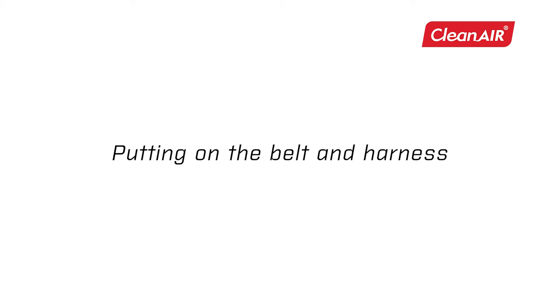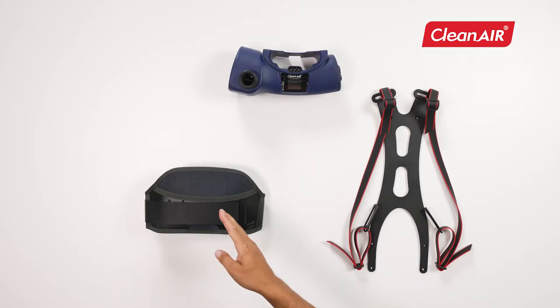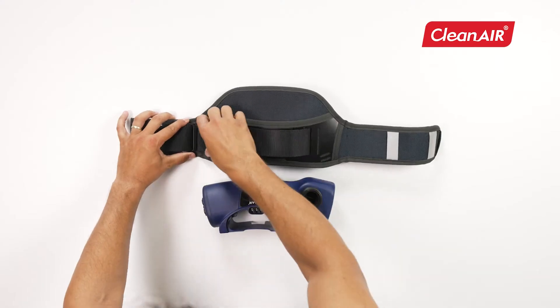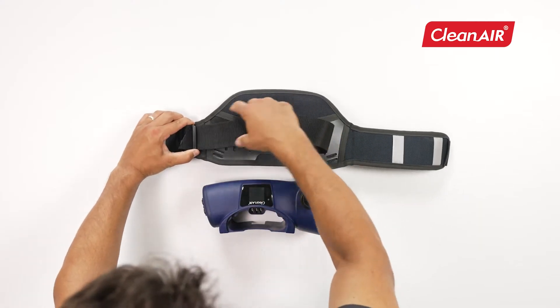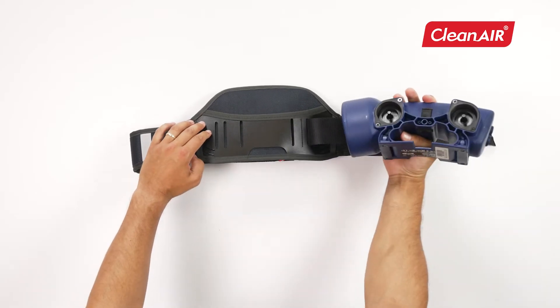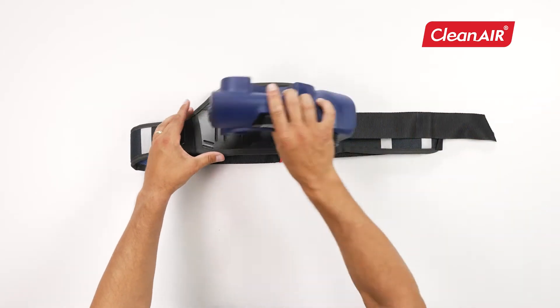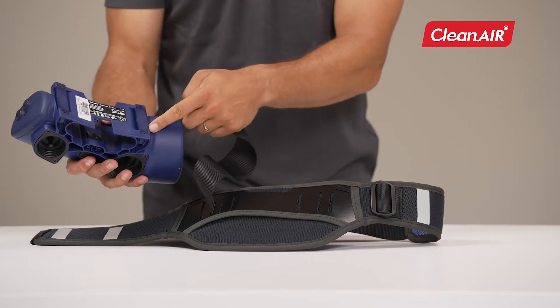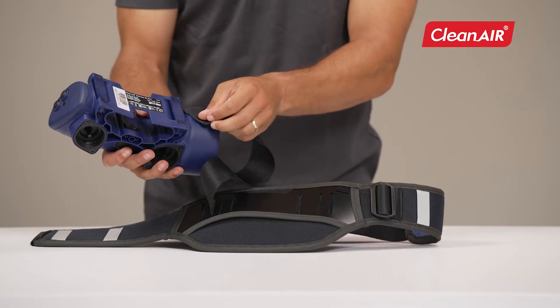Putting on the belt and harness. Align the unit correctly with the belt and extend the part down. Thread the belt strap through the holes in the unit and the belt in the correct order as shown in the video.